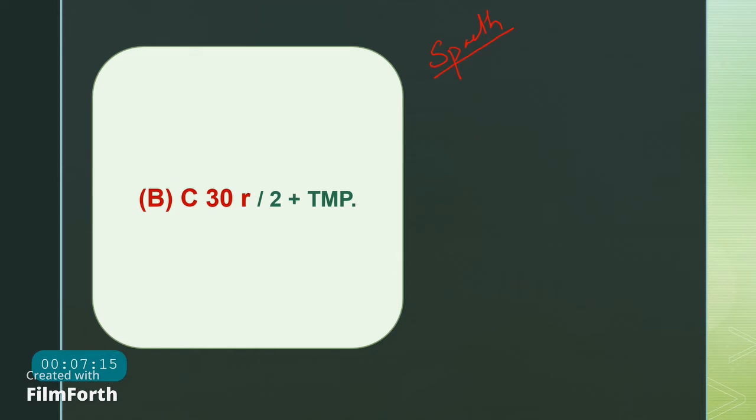So what does this notation mean in this picture? Now, what did I tell you about B and C? B means that it is inserted behind the Schwalbe's line, and C means that it is inserted onto the scleral spur. Now, when B is put in the bracket, it means that before indentation, we were able to see up to the Schwalbe's line. And then after indentation, the trabecular meshwork was also visible, and it means that the iris is inserted on the scleral spur. So that is how the notation is written.